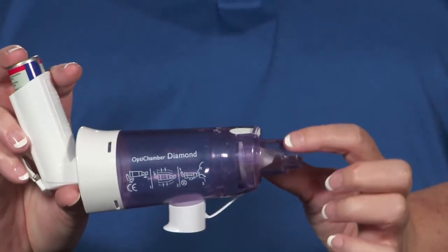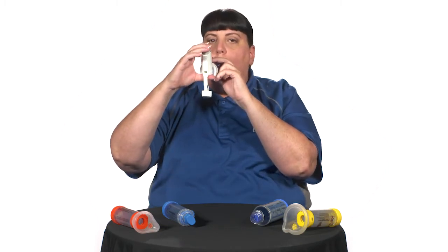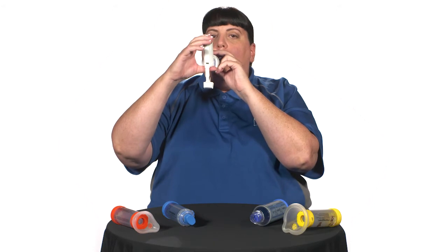Hold the MDI and spacer away from your mouth. Breathe out all the way like you're blowing out a candle, but don't ever blow into the hole. After you've blown all the air out of your lungs, keep your head up, put the spacer opening in your mouth, and close your lips around like you would a straw. Push the top down on the MDI once and breathe in slowly and deeply through your mouth until you can't breathe in anymore like this. Now, if you breathe in too fast, you won't get all of the medicine into your lungs.